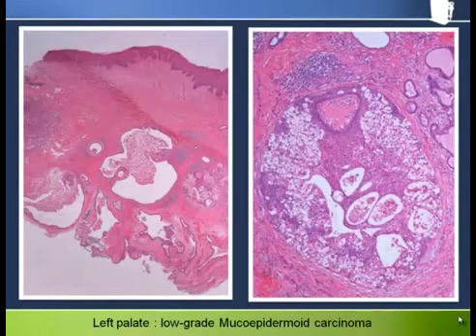The biopsy showed the presence of a type of salivary gland tumor, a low-grade mucoepidermoid carcinoma. What's striking here is that this is not an epithelial-based cancer. In fact, the overlying epithelium is essentially normal. One might have thought that a visualization tool such as the VELscope would not be sensitive to this type of tissue change. In fact, this shows the sensitivity of the VELscope not only to the epithelium, but also to connective tissue changes. We saw this as it related to breaking of collagen crosslinks in our discussion of the pathogenesis of dysplasia and squamous cell carcinoma.